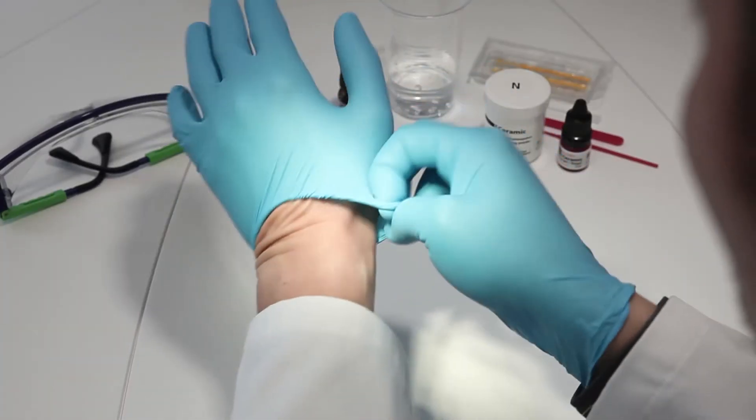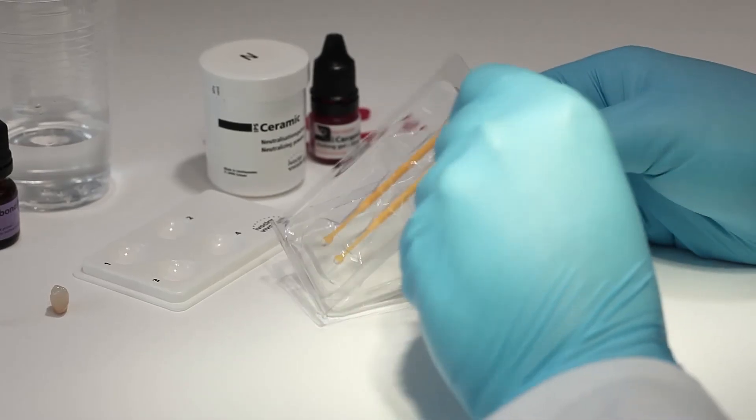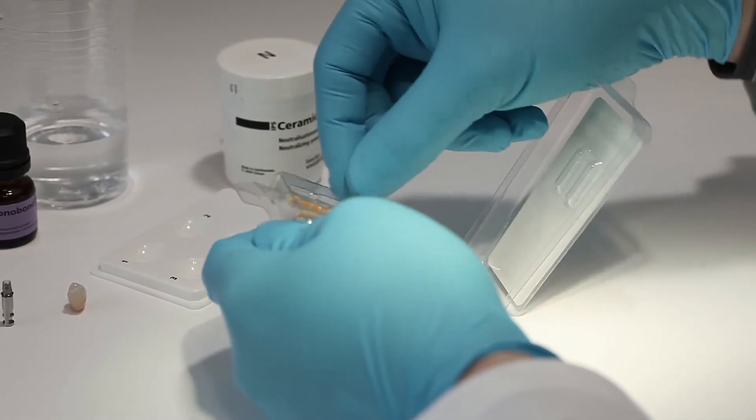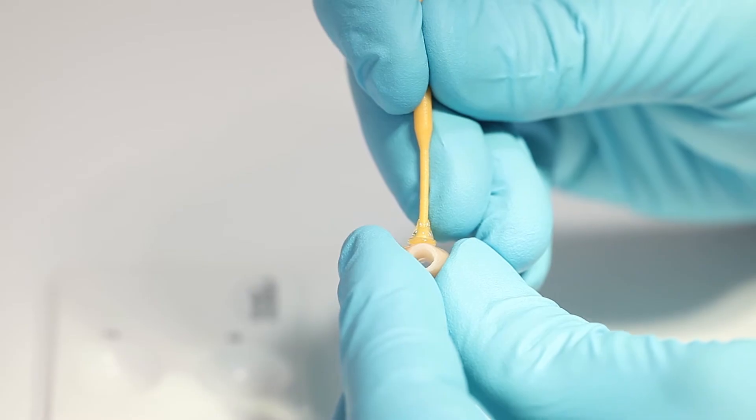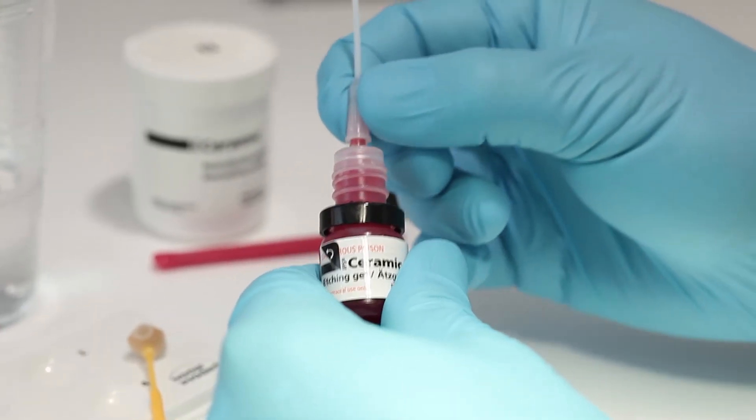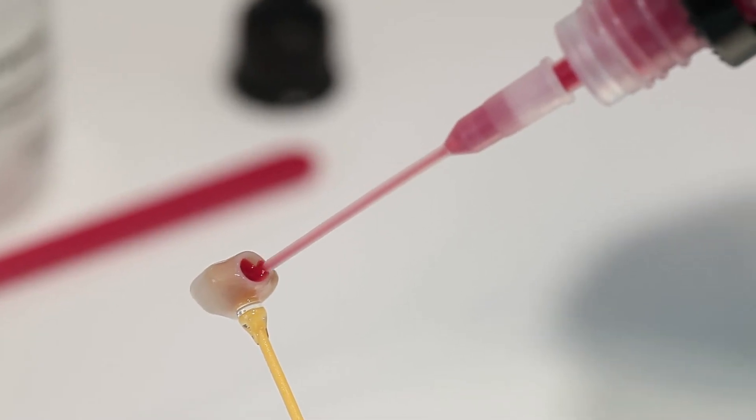The IPS-EMACS CAD ceramic structure must also be conditioned before cementation. Under no circumstances should the ceramic structure be sandblasted. Apply IPS ceramic etching gel to condition the bonding surface and allow to react for 20 seconds.